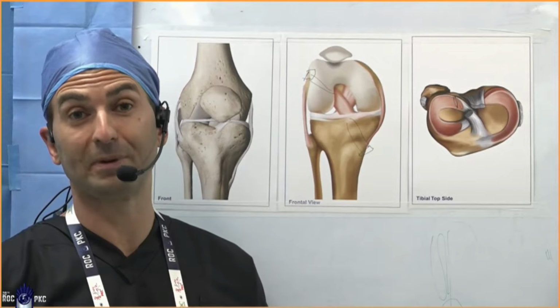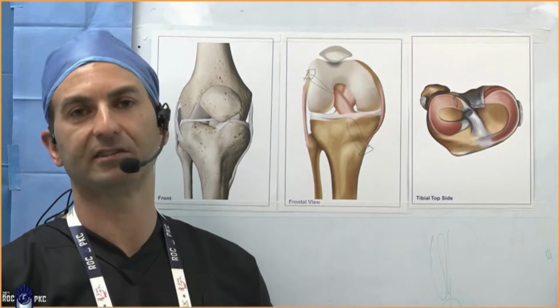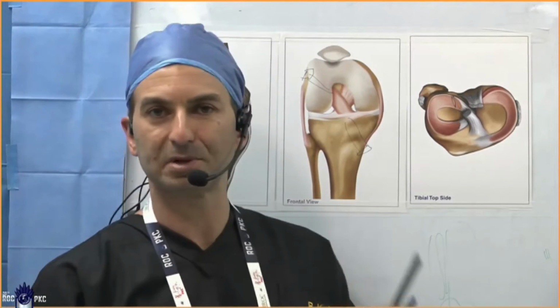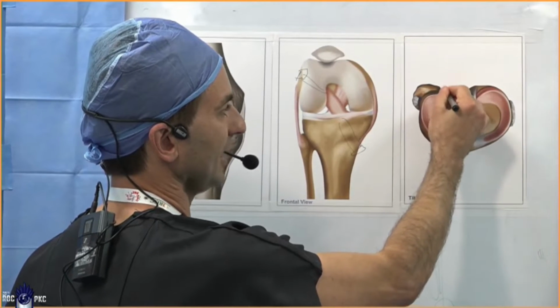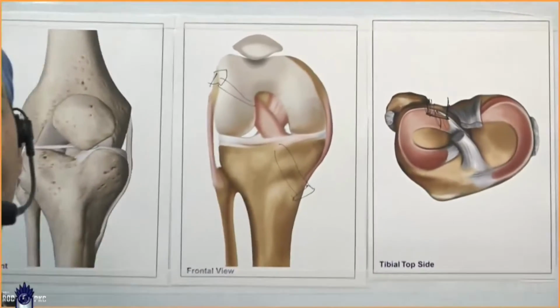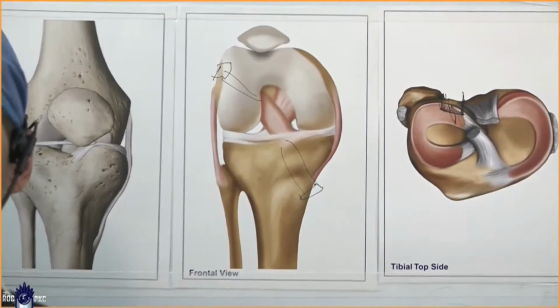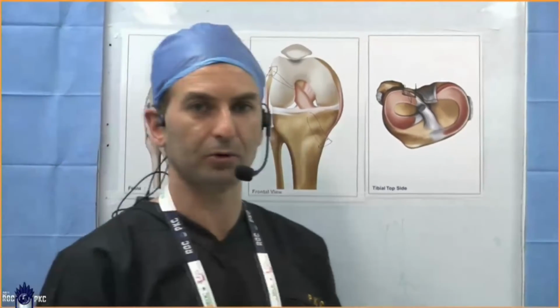We'll do a root repair if we need to, but almost certainly we'll need to do some sort of side-to-side fixation supplemented with vertical fixation. So the plan will be some sort of hashtag repair, stabilising each part, the root side, the body side, and then likely side to side across that using either a combination of FasT-Fix Flex and potentially NovoStitch. We'll use a number of portals for that.